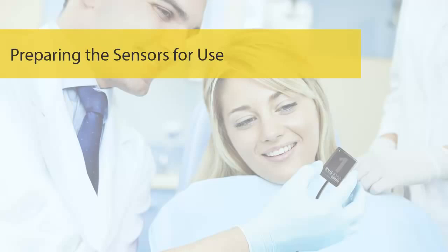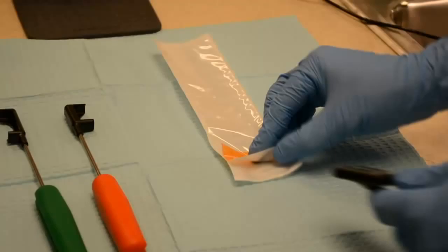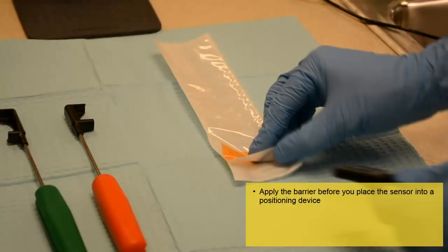Preparing the sensors for use. You must cover the sensor with a barrier prior to use. Apply the barrier before you place the sensor into a positioning device. If you need to change positioners during use, you do not have to reapply a barrier.